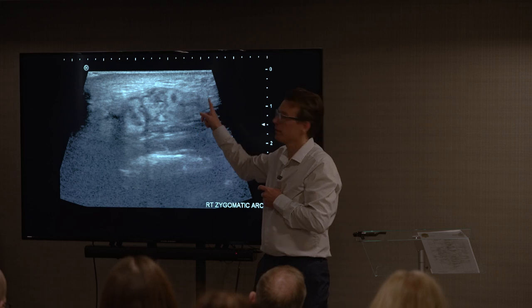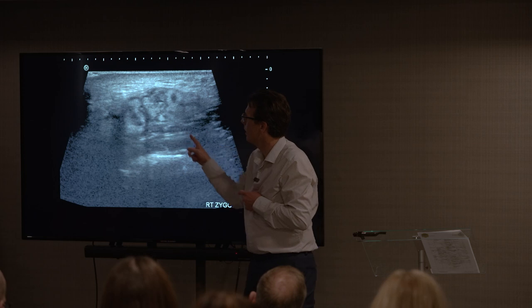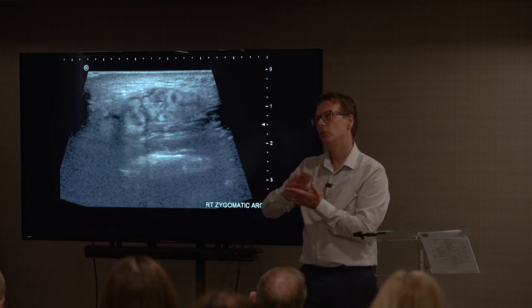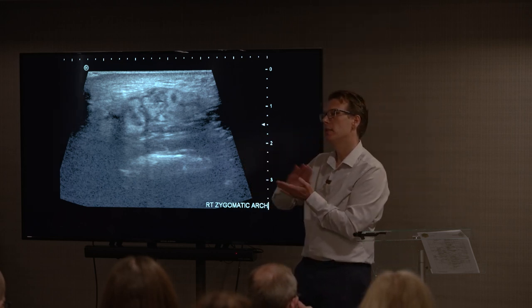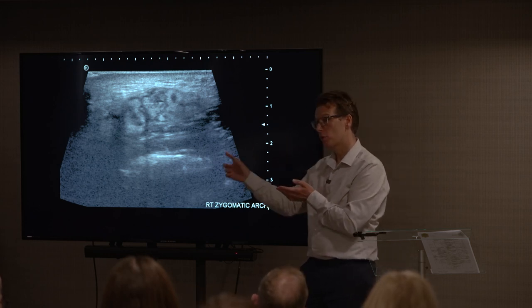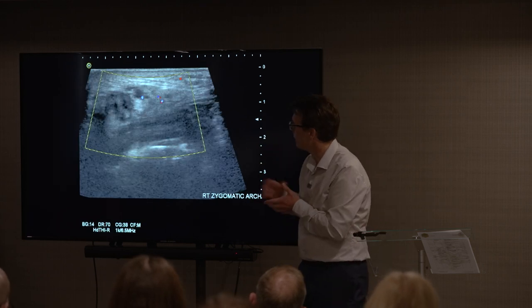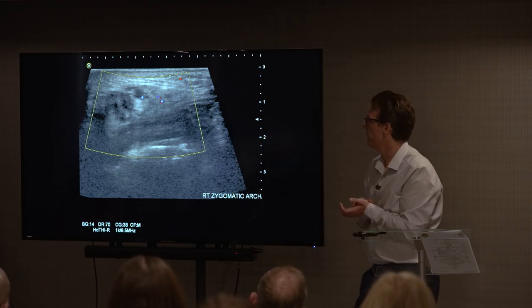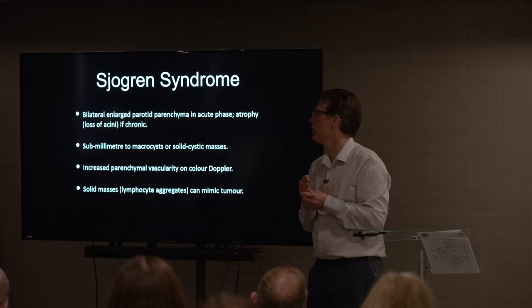This is a picture of the accessory parotid gland — you can see how heterogeneous it is in terms of echogenicity. Compare this to the normal parotid gland we looked at earlier, which was uniform. I always keep that image of normal in the back of my head so I can spot abnormal. The next image shows some color Doppler — not as florid as I'd expect, but there is some Doppler signal present.